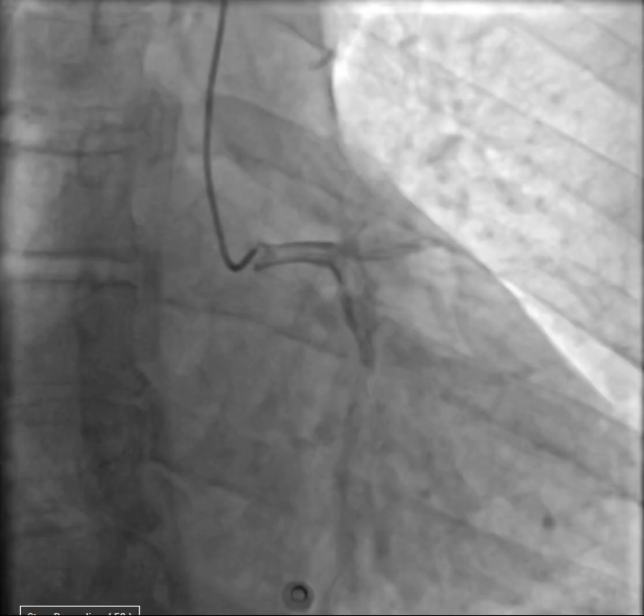In today's video, we have a 7-year-old patient who was brought in for primary intervention. Stay with me to see what happens next.